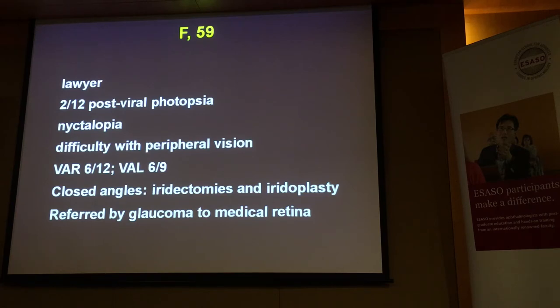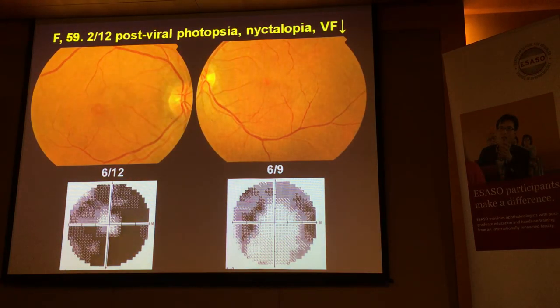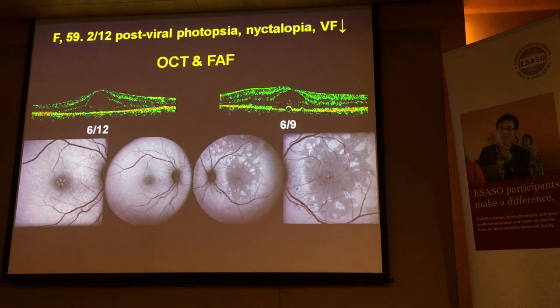So it sounds all trivial. Fields, well, they're not glaucomatous. Look at the fundus and you'd be forgiven for thinking there's some fluid around here. There are quite clear changes of the fovea. But what really threw us is this, because we'd never seen it before. Even though we were the people who started autofluorescence, we had never seen this appearance. I took these images up to Alan Bird, because we'd assumed this was the cystoid macular edema, with the petaloid appearance, and we thought this was nasty. I remember it very well, because he just looked at them and said, bloody hell, what's that? We assumed that this was the bad bit. We were, of course, completely wrong.